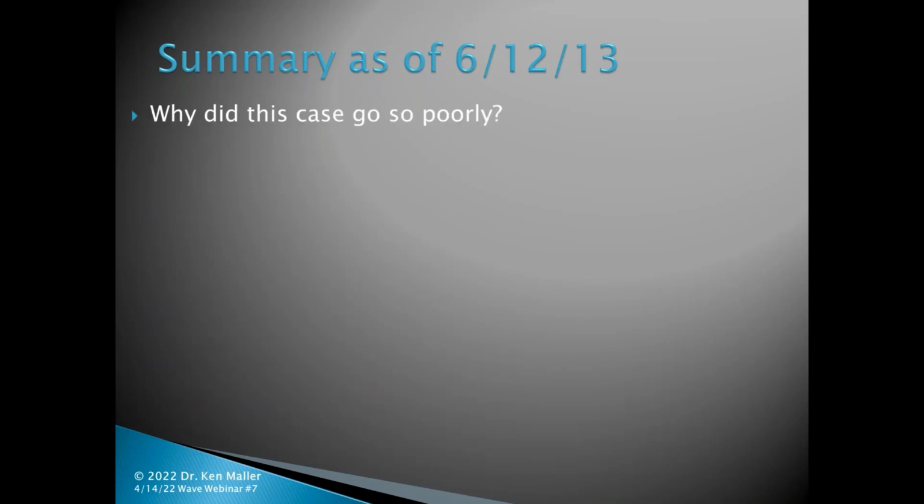So the question is, why did this case go so poorly? What were really the problems that necessitated 5 pairs of lenses, an abrasion, finally arriving at a pair of lenses giving him uncorrected acuity of about 20/40, undertreating him by about 1 diopter?